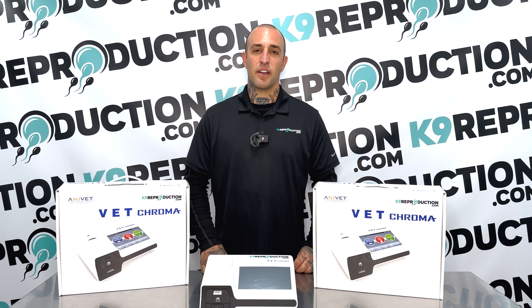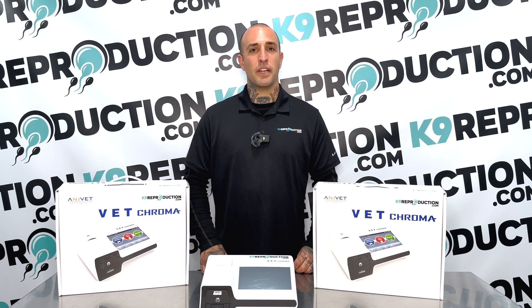Travis here with caninereproduction.com. Today we're going to have a close look at the VET Chroma canine progesterone analyzer and show you how to do a single test and a multi-test.